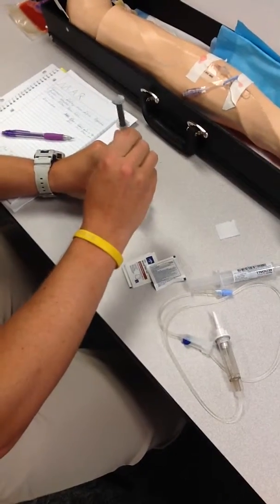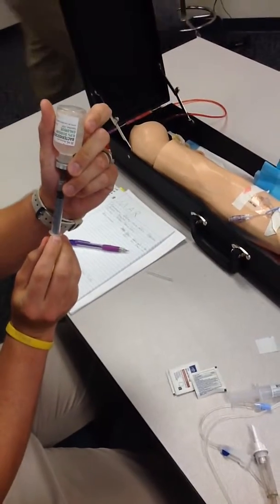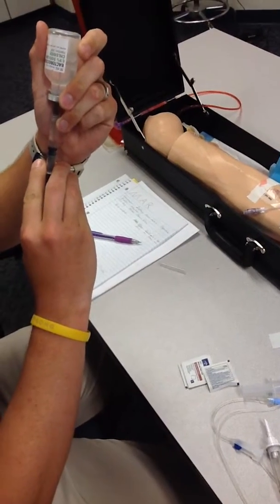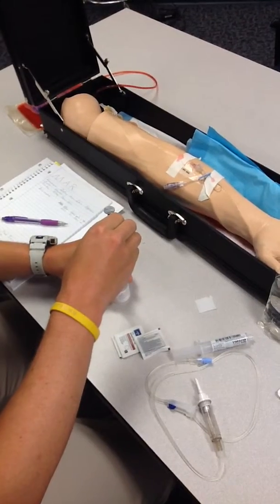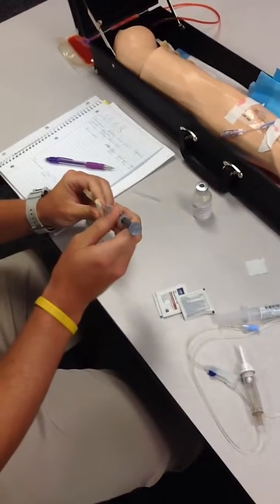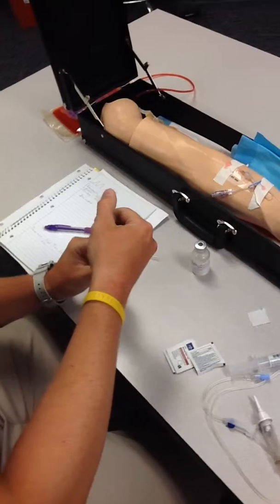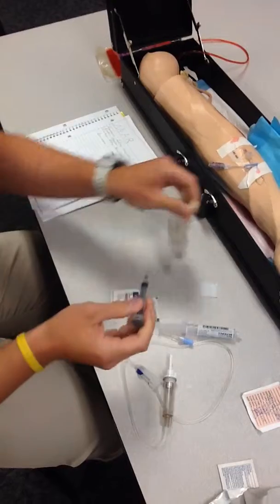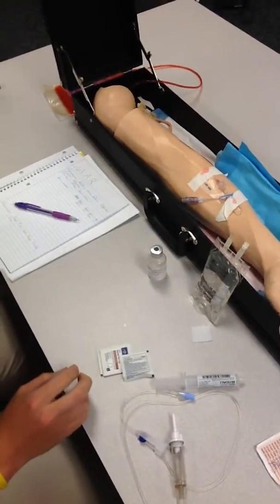Remove the cap, insert. We will inject the air, and we will draw back the 2 milliliters of solution that we need. Pull past, remove any air that's in there. So now we will go straight into the Minibag. Alright, the drug has been administered into the Minibag. We will cap, and we will remove that into the sharps bin.